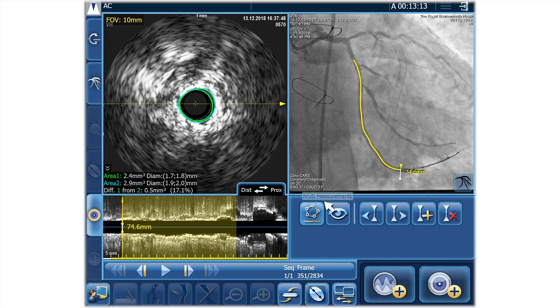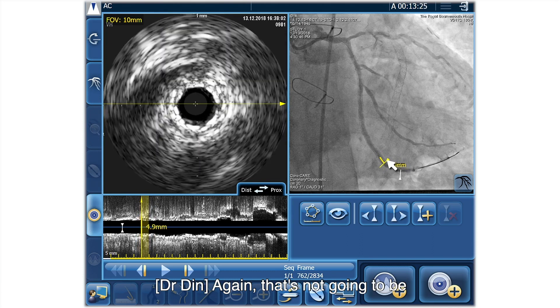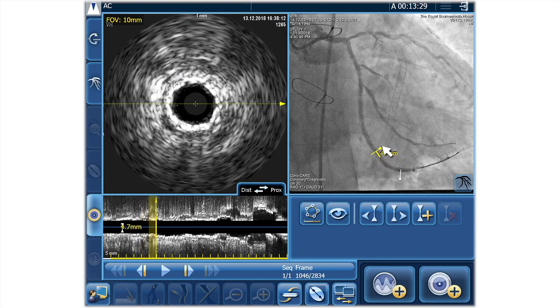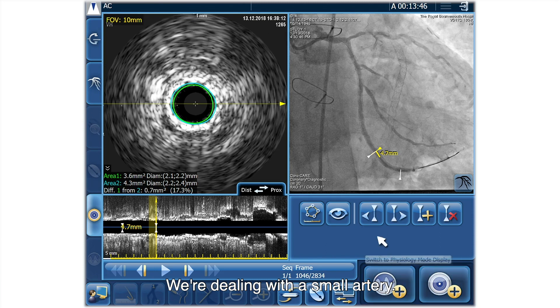And then as we come up, I quite like the way you can just look at it on both aspects - you can scroll up the vessel or scroll along the longitudinal. That's not going to be any bigger than 2.5. That's kind of where we had the problem. Even when it gets a little bit bigger, 4.3 there - so a little bit bigger. It's a small vessel, we're dealing with a small artery.